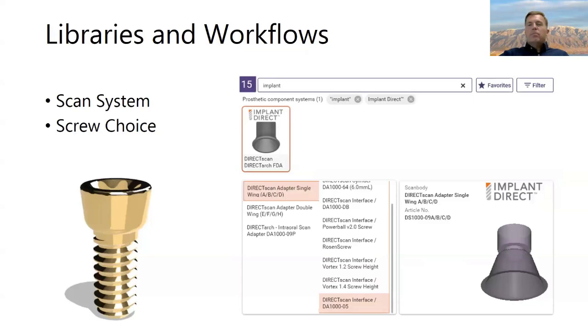Man, I'm sure you guys have dealt with single implant situations where your laboratory called you and said, I'm sorry, we can't make a custom abutment on this case because there isn't a custom abutment file associated with this scan body. You're like, what? But our digital workflows are similar.